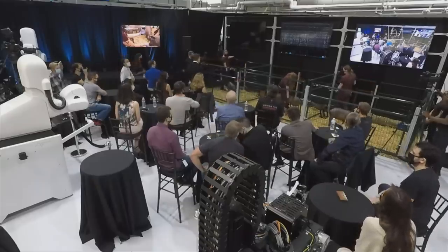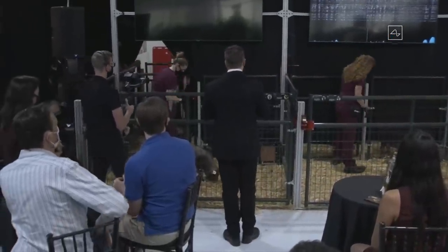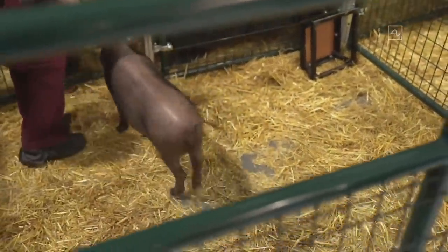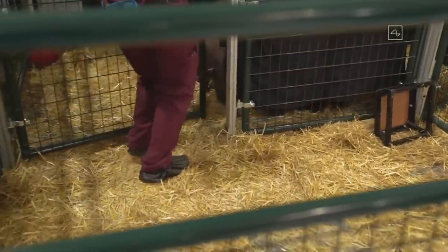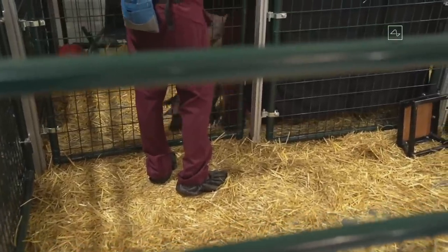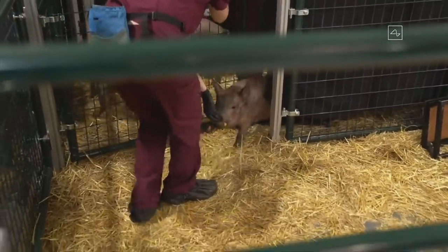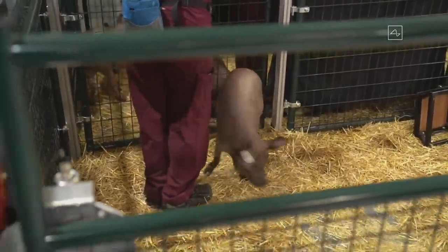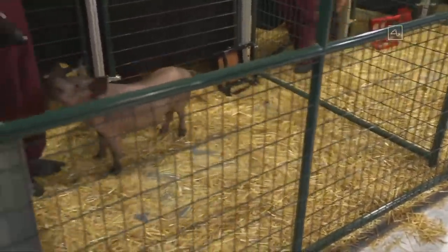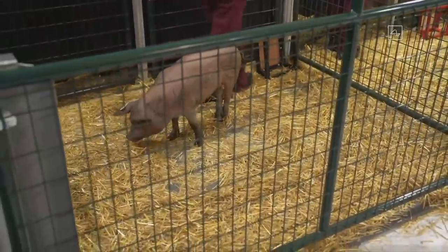What if we do two Neuralink implants? We've been able to do dual Neuralink implants in actually three pigs at this point, and we have a couple of them here. We've been able to show that you can have multiple Neuralinks implanted — and again, healthy and happy and indistinguishable from a normal pig. So it's possible to have multiple links in your head, all sending out signals, and be working well.